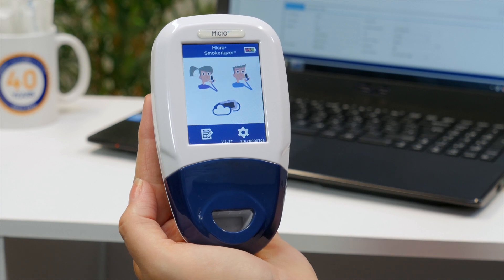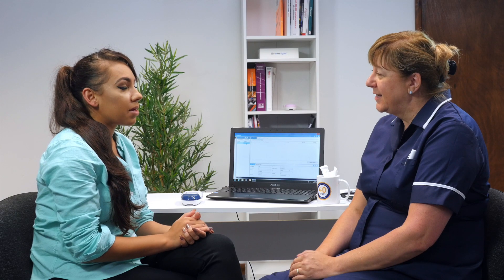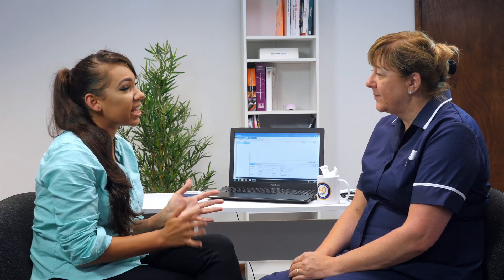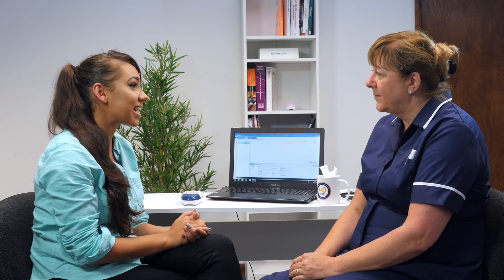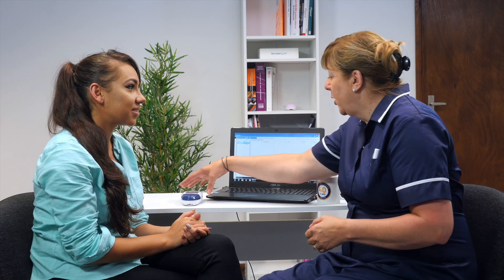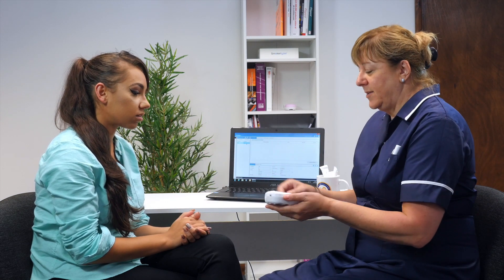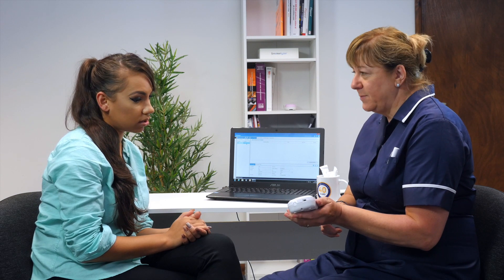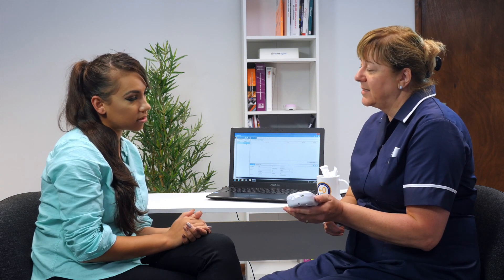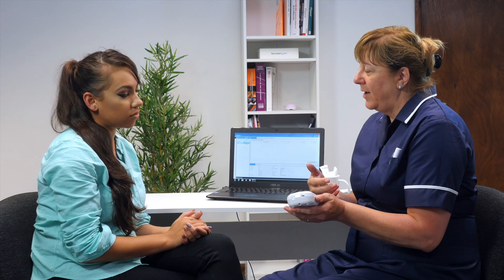It works by non-invasively measuring carbon monoxide on a smoker's breath. By measuring the levels of CO on a smoker's breath, smoking cessation advisors can also see how dependent a patient is on tobacco.